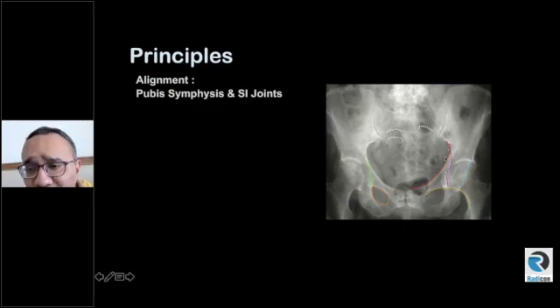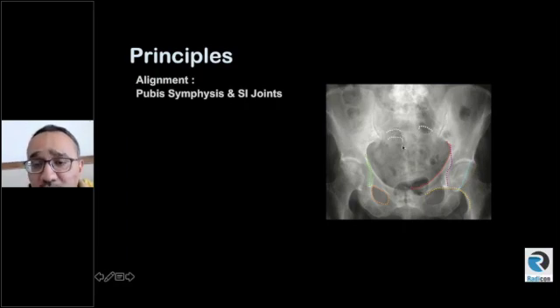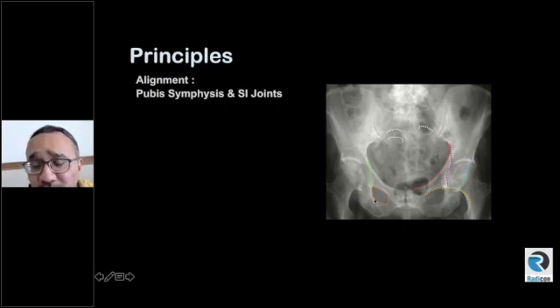Then there is the red line, which is the iliopectineal line. You have the purple line — the ilioischial line — you have the acetabular walls, and then don't forget the white lines at the back outlining the sacral hiatus and the sacral foramina. These are called arcuate lines. Then there is the teardrop, and you can also draw the margins of the obturator foramen.